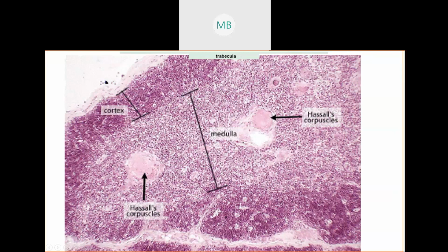So once again, labeled. That brings us to another couple of words on our list. The regular cells that you can see are called reticular cells. So all of these regular cells that you can see with the nuclei and the other parts are all called reticular cells.